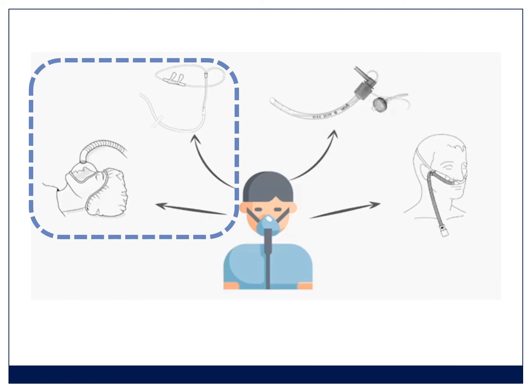Secondly, putting on nasal prong oxygen is a step that's now recommended. You attach that to your auxiliary oxygen supply, which most anesthetic machines have, and you run that at 5 liters per minute. So you put the nasal prong oxygen on the patient, then you put the mask over that, and the one is running at 10 and the one is running at 5. Then once the patient's asleep, you take away the tight-fitting mask, and that nasal prong oxygen continues to deliver 5 liters per minute to that patient. That is called apneic insufflation.